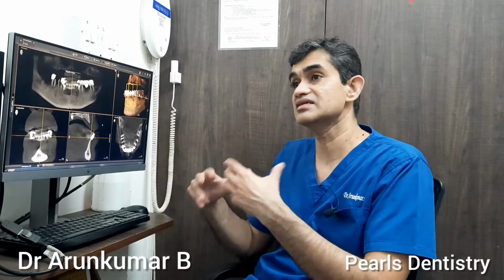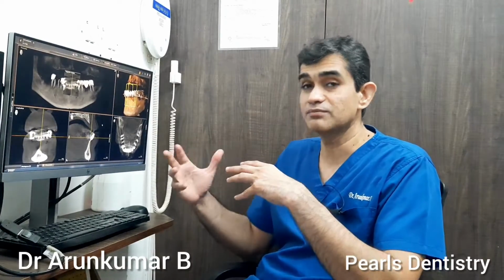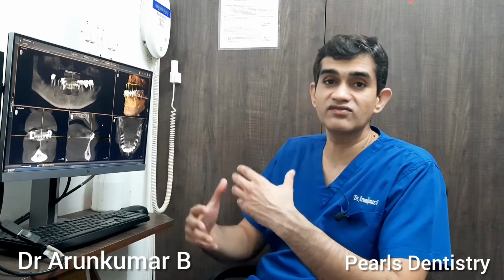So in this particular video, let's look at how a 3D CT scan or a cone beam CT scan helps in actually planning for the implant.